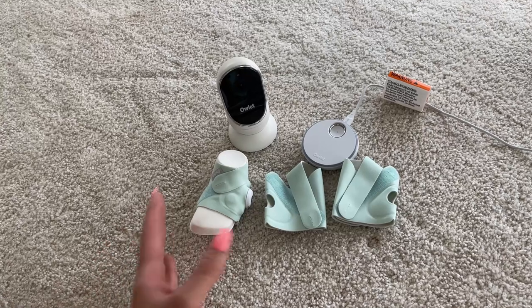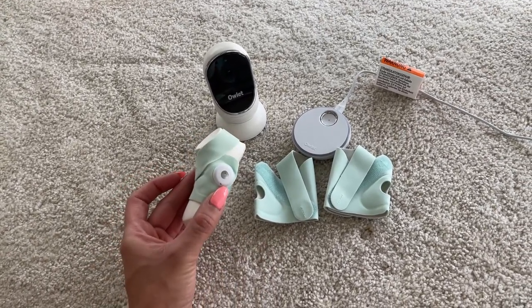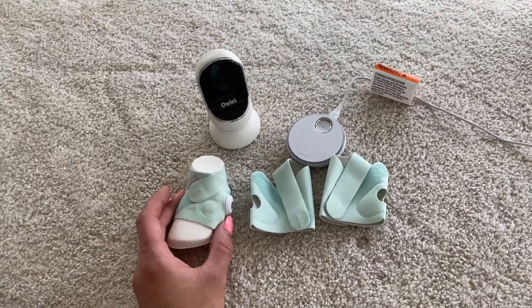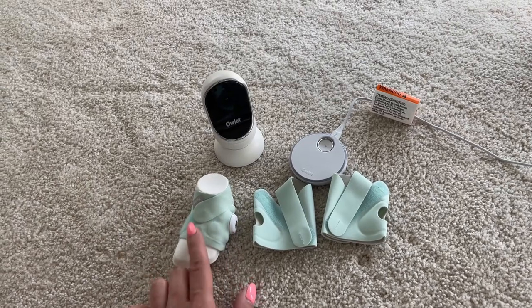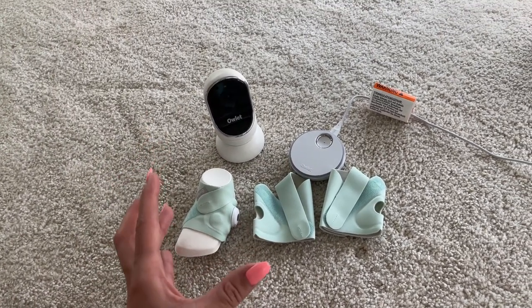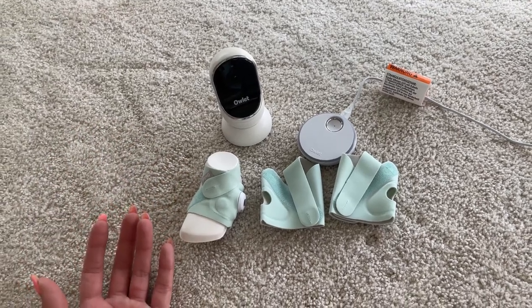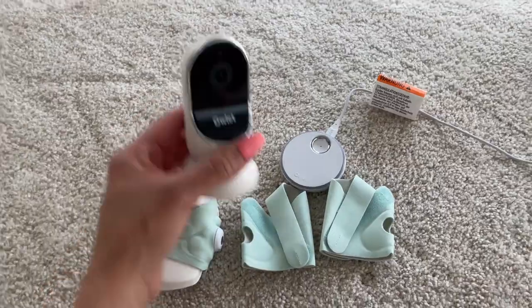My baby's sleep improved so much with this dream sock because of the app and all the sleeping tips that they give you. It really works — you learn your baby's wake windows, which is very important. So if you're having a hard time with your baby sleeping, you should consider getting this just so you know the best time to put your baby to sleep.